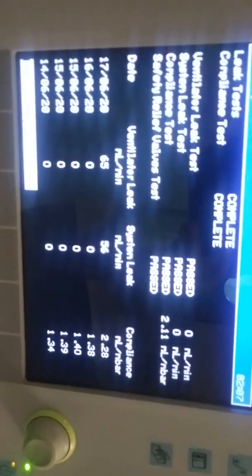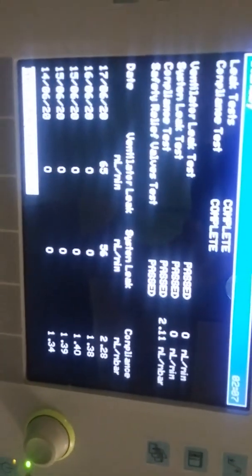After calibration completed we get the results about all leakage - circuit and system leakage. If the leakage is high it indicates that leak test failed, not ready for use. After this we complete all calibration tests. Now our Drager workstation is ready for use.